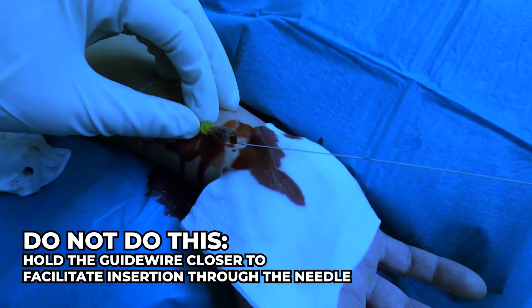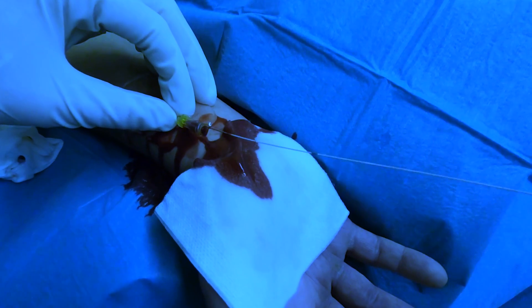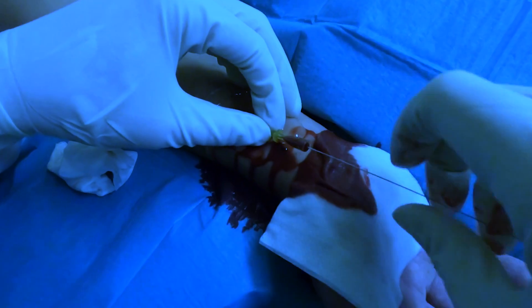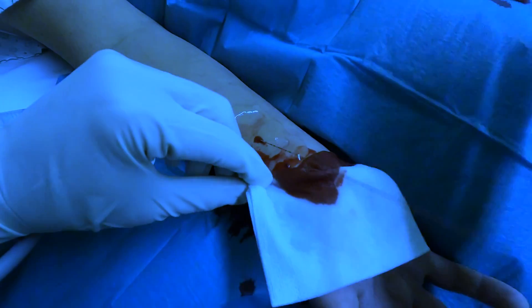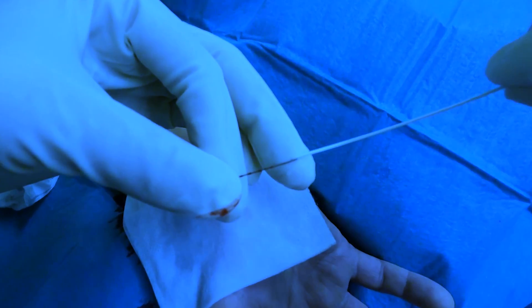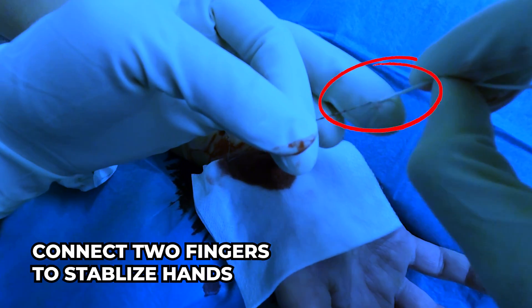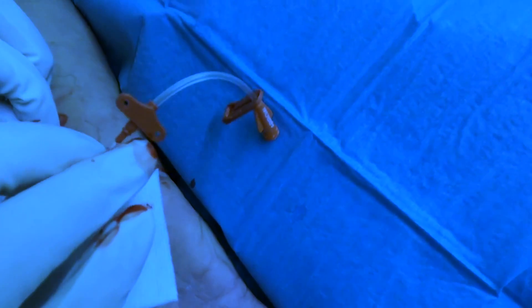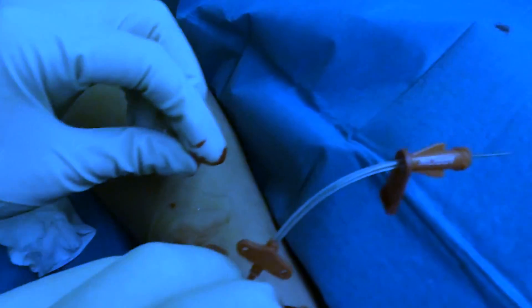Pass the guide wire. The wire is in. We now withdraw the needle, leaving the guide wire inside. Slowly — let me see the end of the catheter here. We're looking for the wire coming out of the end of the catheter. There we go. Now we advance everything as a unit.